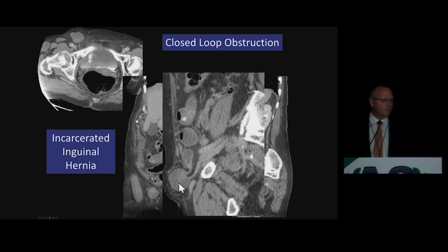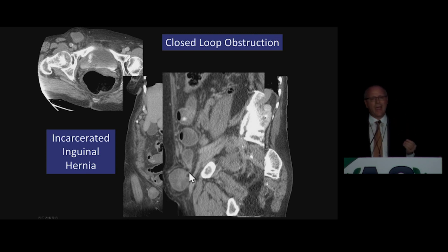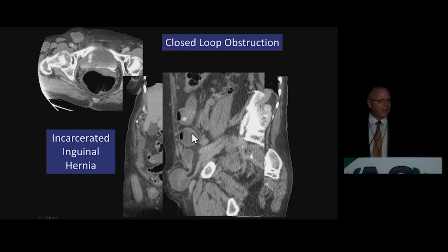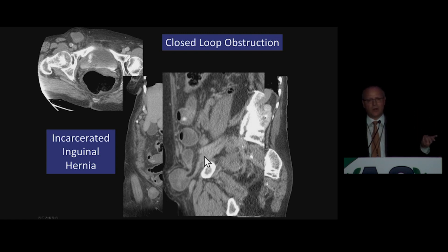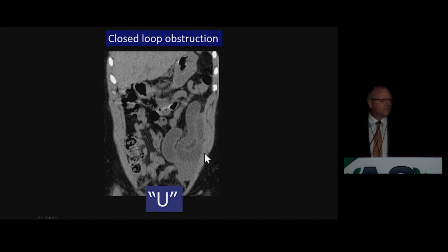We see C or U-shaped loops of bowel in any plane, radial distribution of those dilated loops forming the closed-loop, and we should almost always see two points of transition with the so-called beak sign. In an incarcerated hernia, the closed-loop is a very short segment of bowel trapped in the hernia itself, with two transition points created at the neck of the hernia — an entering site with one transition point where the proximal bowel is dilated, and the exit transition point leading to a collapsed loop of bowel. This concept applies to every single closed-loop, no matter where it is located or what the cause may be.